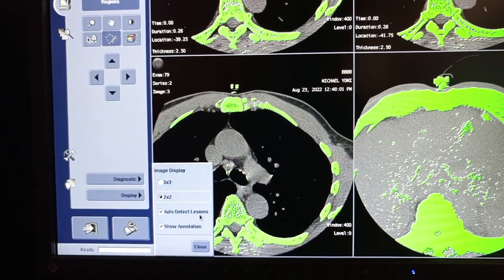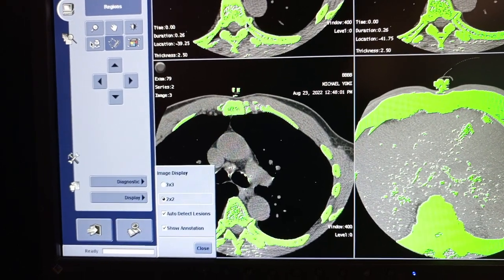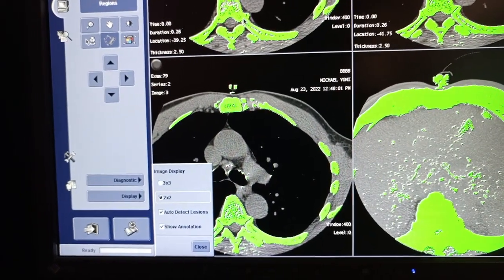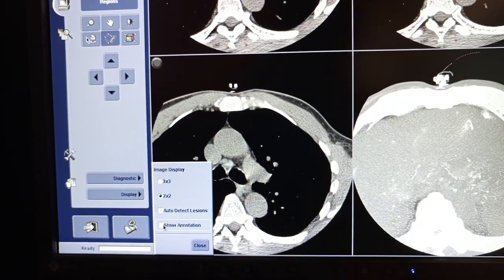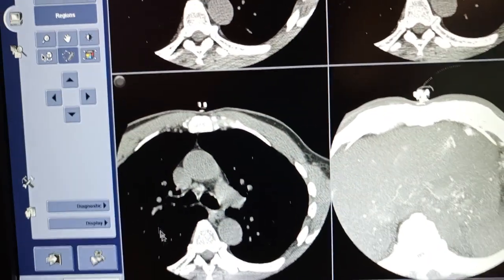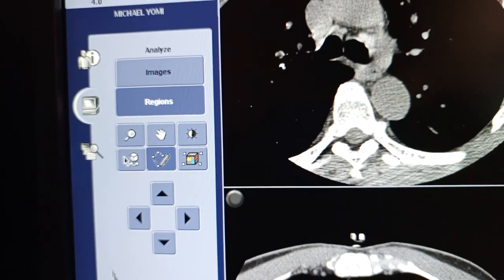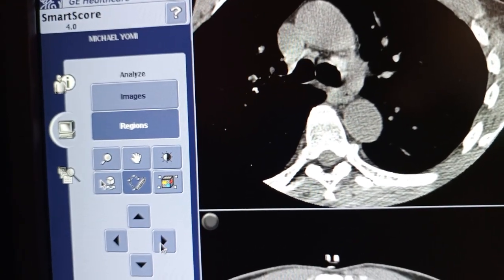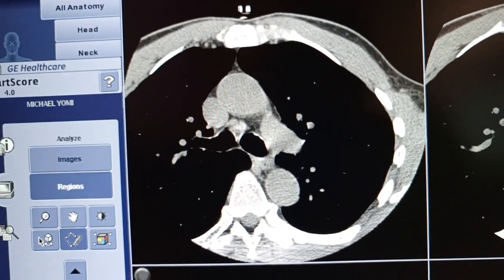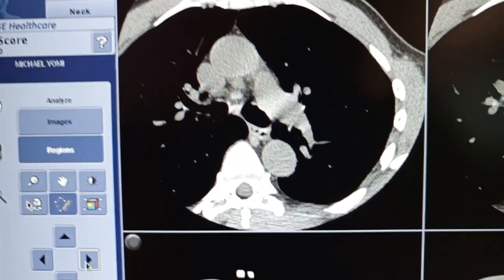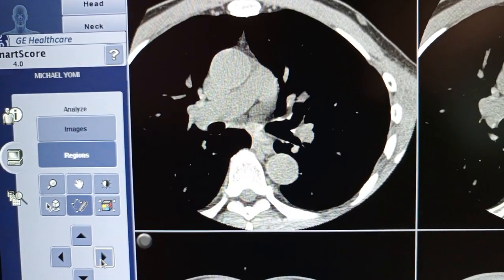Then use auto lesion detect — it has already detected anything with a higher Hounsfield unit value. It has auto-detected lesions for you, and you can deactivate them if you want to do your own manual review. We go through the images one by one using this button.